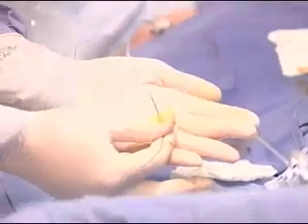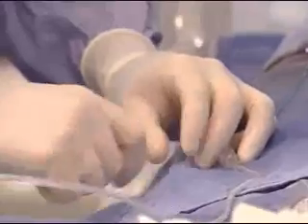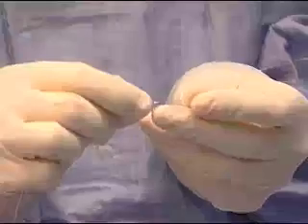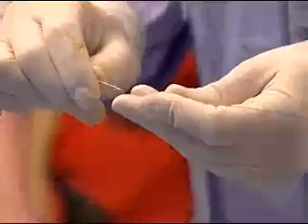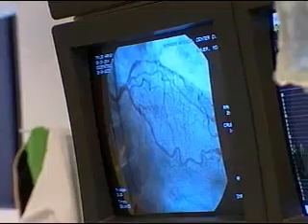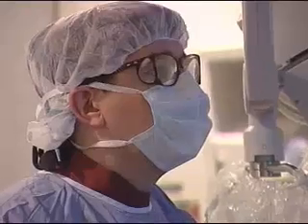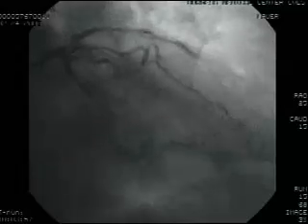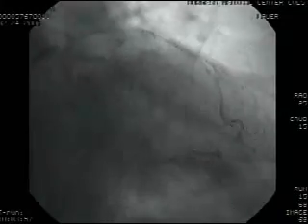Like coronary angioplasty, the Cypher Sirolimus-Coated Stent may dramatically change cardiac care. Coronary angioplasty has been a giant step for coronary artery disease treatment for the past 25 years. The minimally invasive procedure uses a balloon to widen narrowed arteries. Since the advent of the stent, a small expandable wire mesh tube used to hold the artery open, restenosis, or re-narrowing of the artery, has been its major flaw. With drug-eluting stents, this drawback will be largely removed.